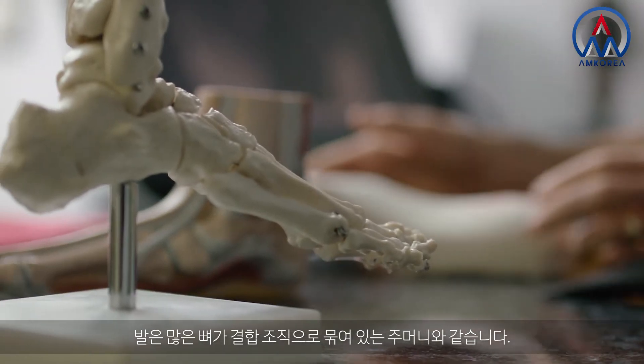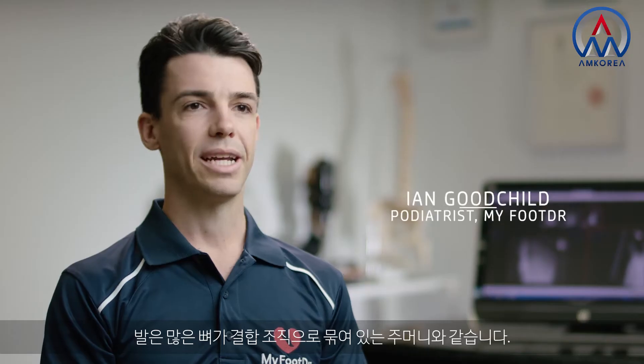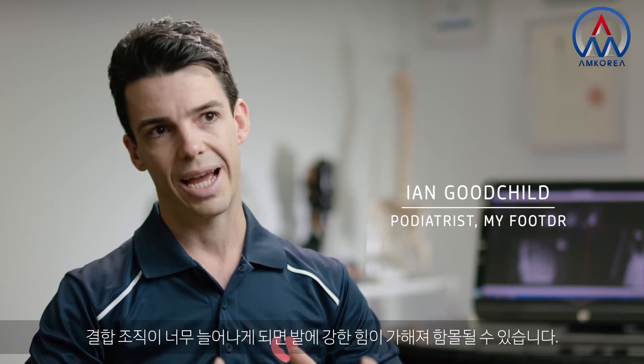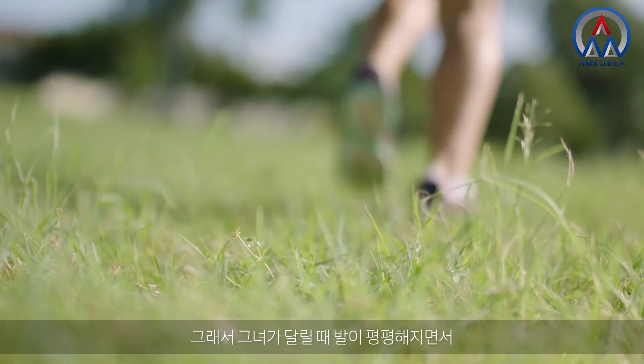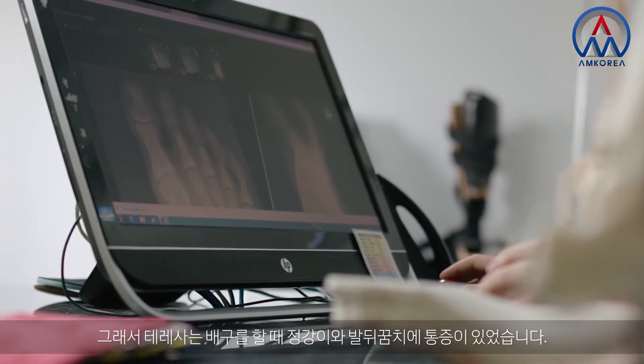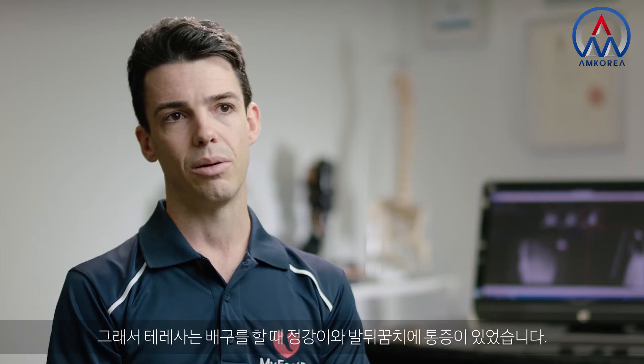The foot being a bag of bones held together by connective tissue — when the connective tissue's too stretchy, the foot can cave with high impact. So when she runs, the foot flattens and that puts extra strain on her arch and on her shins. She was getting some shin pain and some heel pain when playing volleyball. I need orthotics because I have really flat feet.